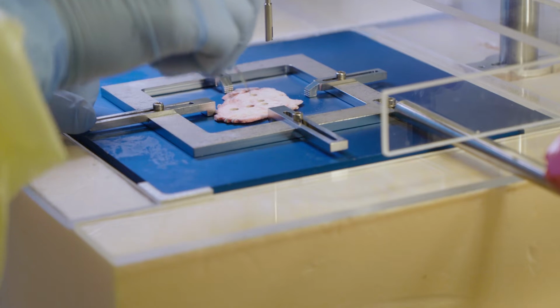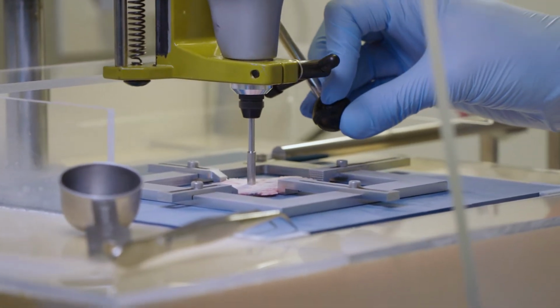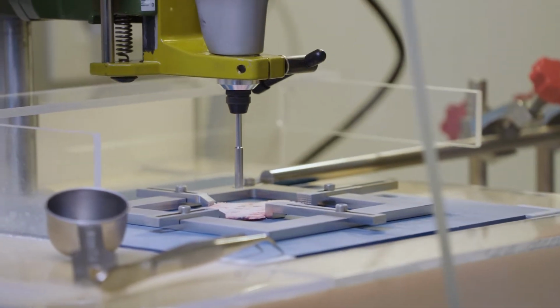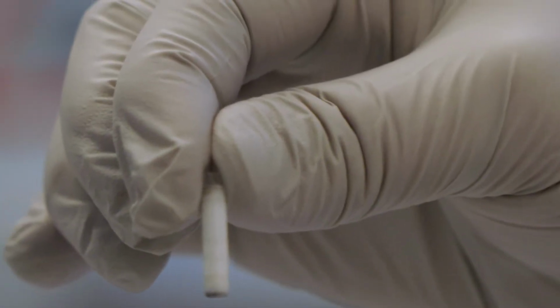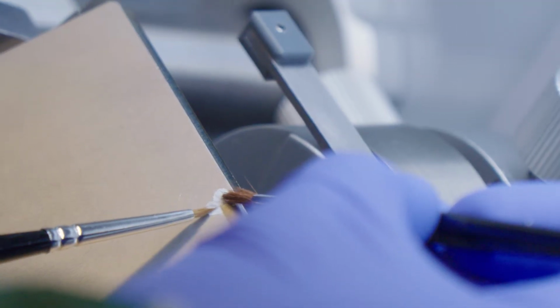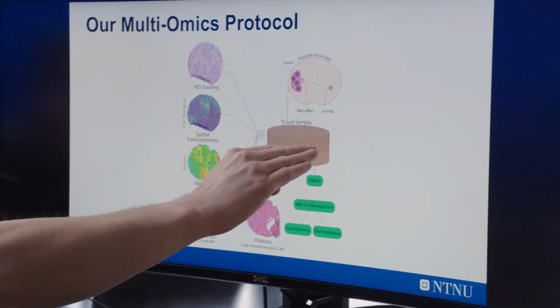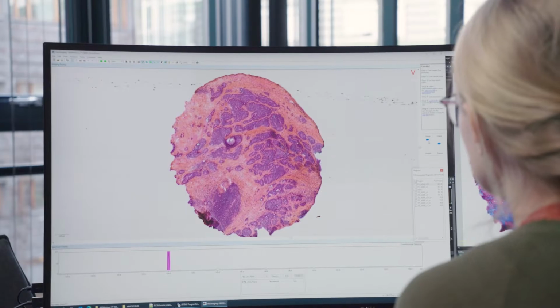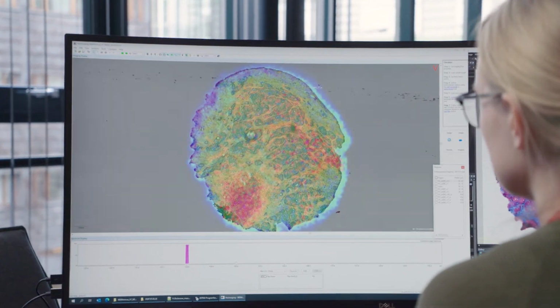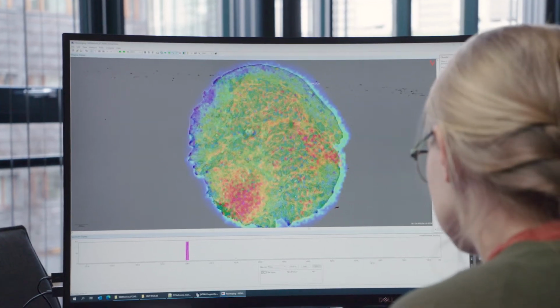And we drill frozen and targeted tissue samples from several places within the prostate to study heterogeneity within the tumor, around the tumor, and also in normal appearing cells. So from each selected sample, we cut very thin sections of the core, which is used for the various omics analysis and histopathology. So we have recently focused on omics methods that provide spatial information within a tissue. We want to understand the molecular mechanisms within the tissue microenvironment.